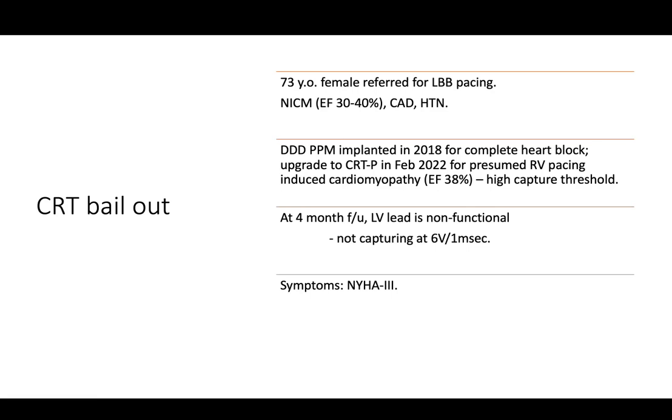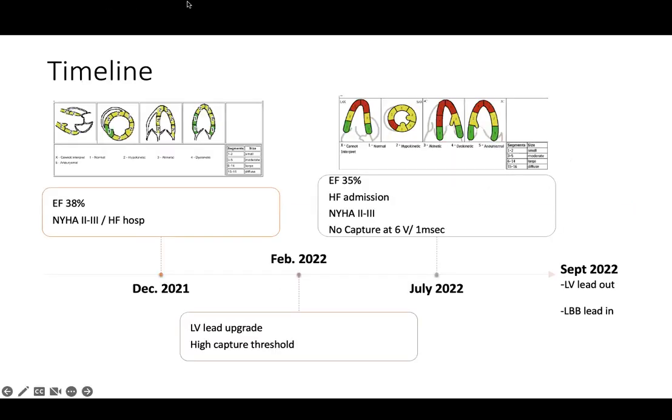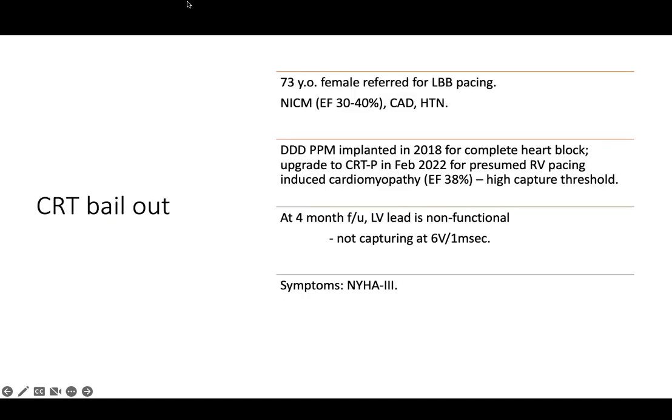You know, if you have some cases already that you know are very narrow QRS, and you have a rapid transition in V2 like that, and the patient's being followed in outpatient clinic, just do an ECG like that and see. I want to put together a number of cases to maybe publish it, but I spoke to the guy who showed it in Czech Republic, and he has a few cases too. Certainly I didn't see any cases where it was worse. If anything, it's a little bit more. It's almost worth doing high, medium, low, and just seeing for like 10 cases or something.